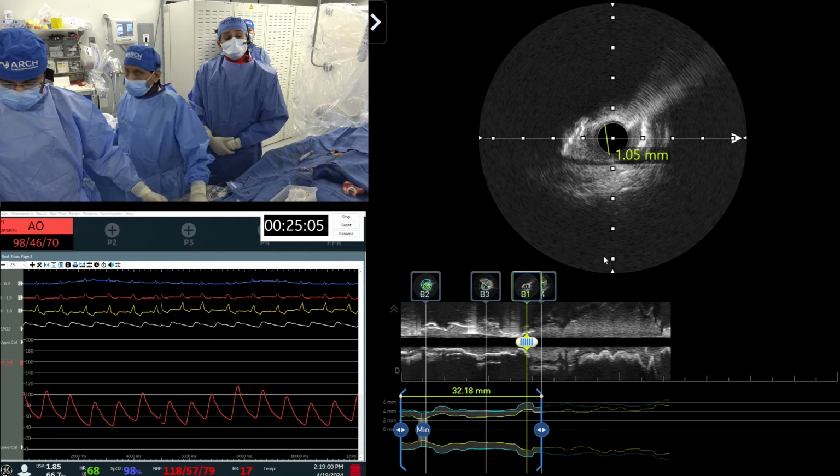So now you got your burr down there. Yeah, that's perfect. When do you burr the diagonal, Jeff? I wouldn't do it now. I wouldn't do it because of the wire bias. I wouldn't go with those angles. If you can't cross it, you can't cross it. But now we have modalities. You created your luminal gain proximally, and then I would probably use balloon technology here, and I'd use lithotripsy for the diagonal, after you've actually created more lumen and have more push from the 2.0 compliant balloon.